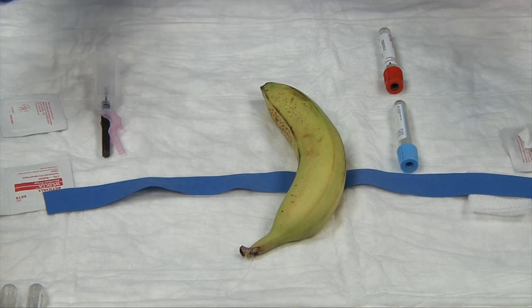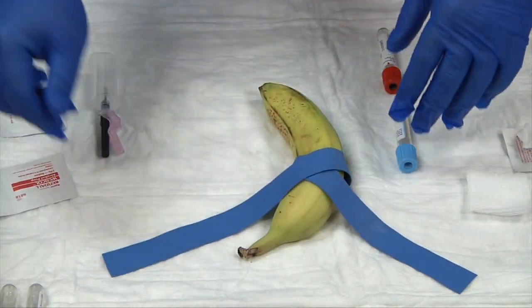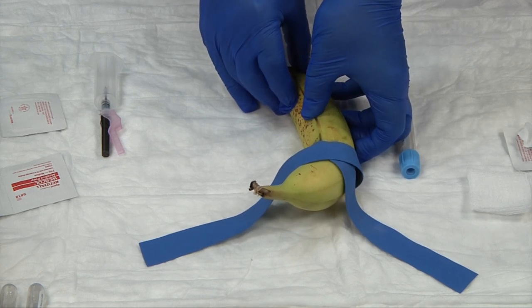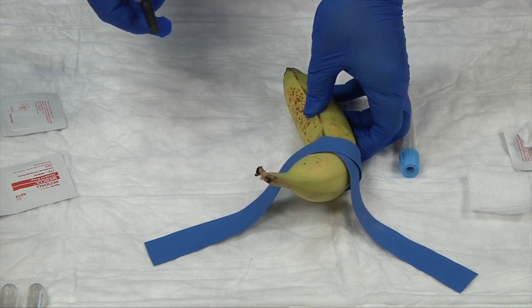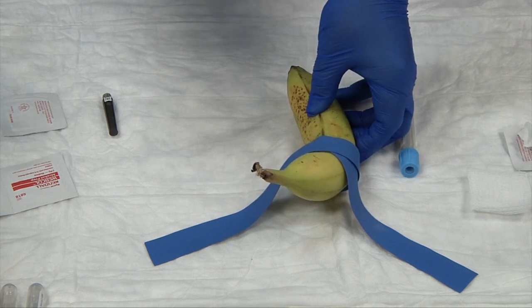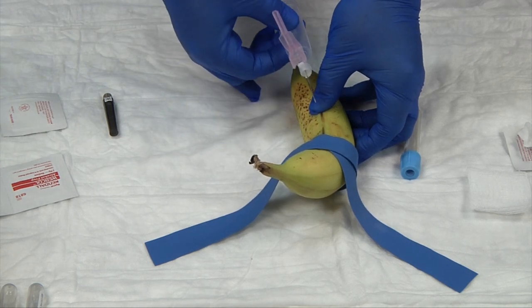The alcohol is already dry on our patient, so let's place the tourniquet back on. With my non-dominant hand, I'm going to anchor the vein by taking my thumb and gently pressing down and back a little bit to pull the skin tight. With my dominant hand, I take the needle, release the cap, and check for any barbs or defects on the needle — make sure it's completely perfect.